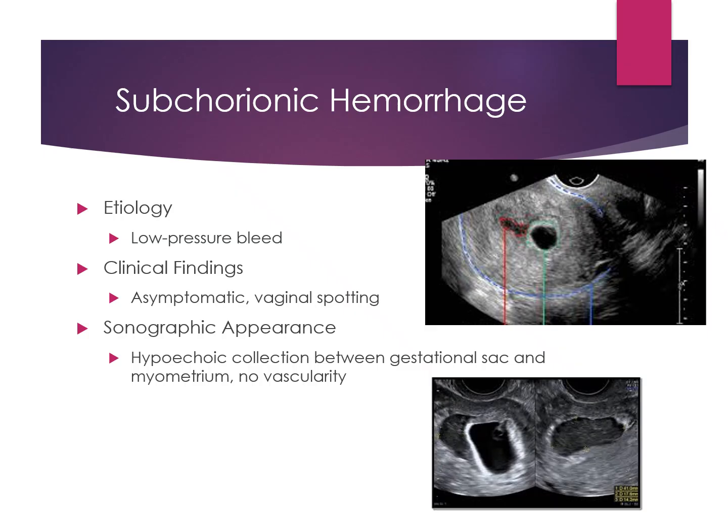And so if we see this hypoechoic complex mass laterally to the gestational sac, we need to document it and measure it, because some studies have suggested that if it is more than half the size of the gestational sac, it'll most likely lead to a fetal demise. So we need to watch it. If it's something small like this, probably not. Something large like this, we could potentially lose the pregnancy. So we want to document that for our radiologist.